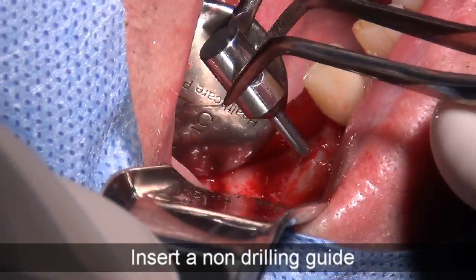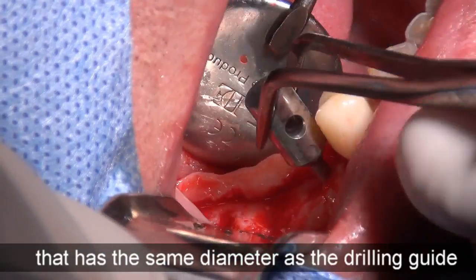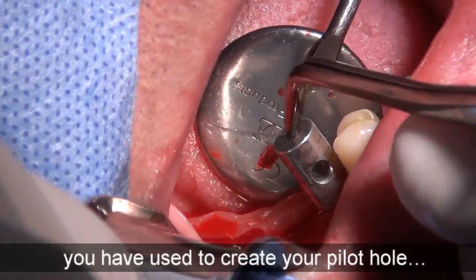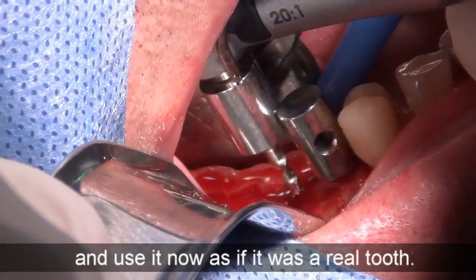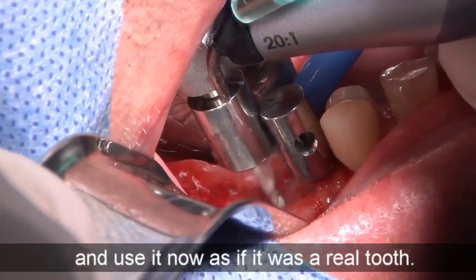Insert a non-drilling guide that has the same diameter as the drilling guide you've used to create your pilot hole, and use it now as if it was a real tooth.